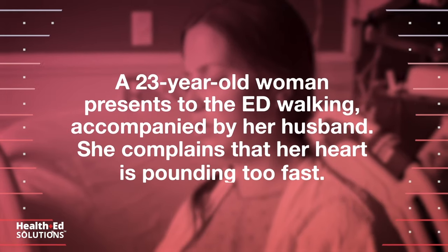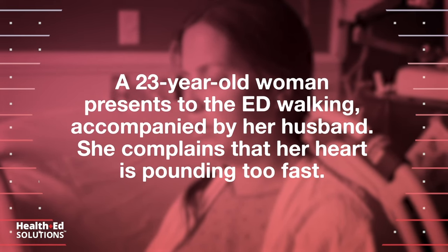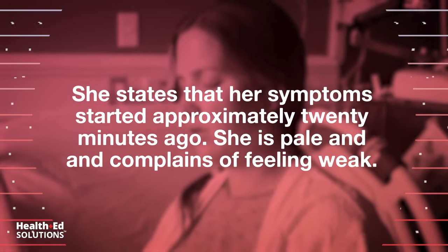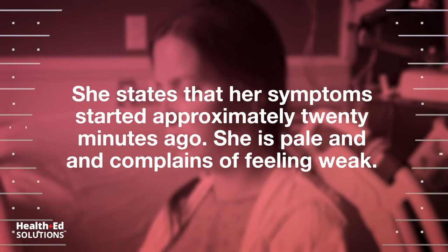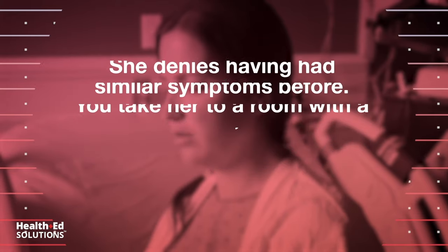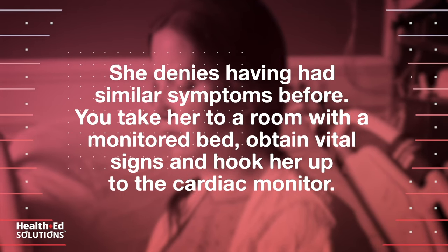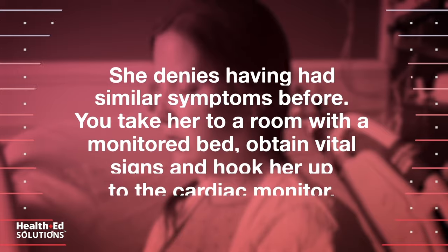A 23-year-old woman presents to the ED walking, accompanied by her husband. She complains that her heart is pounding too fast, with symptoms starting approximately 20 minutes ago. She is pale and complains of feeling weak, and denies having had similar symptoms before. You take her to a room with a monitored bed, obtain vital signs, and hook her up to the cardiac monitor.